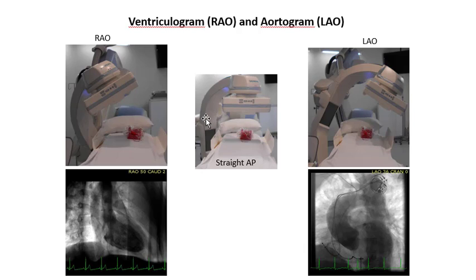And the machine can rotate around the patient sideways and caudally or cranially, towards the feet or towards the head. So we have a full, almost hemispherical field of view of the patient, focusing on his heart, of course. And here you can see the rotation going to the patient's right. Our left, but it's the patient's right-hand side, just like in a chest X-ray.